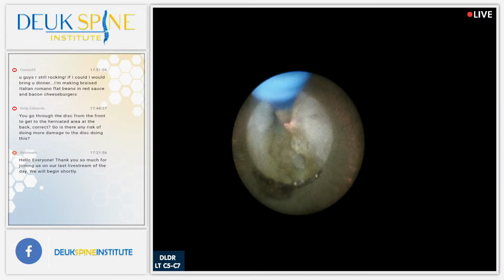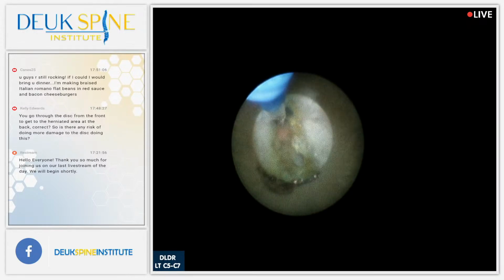Am I anywhere near the fiber? Am I good? No, you're good.